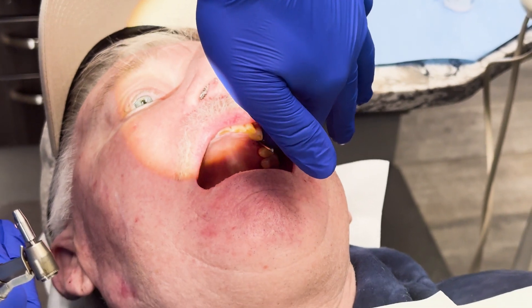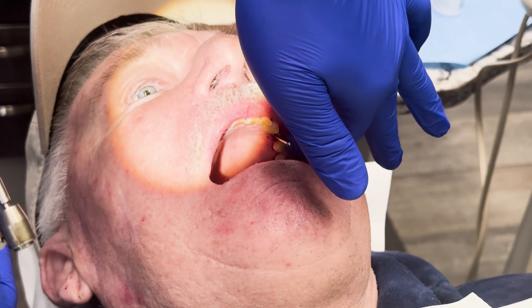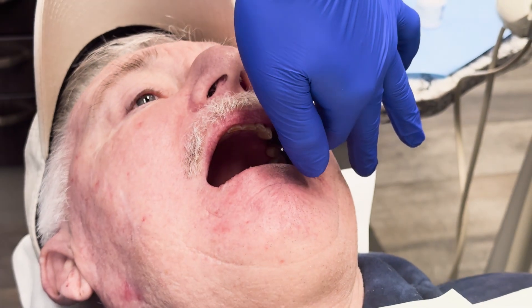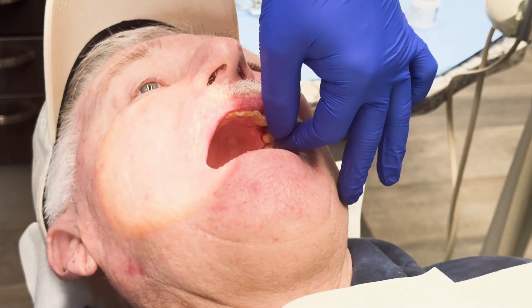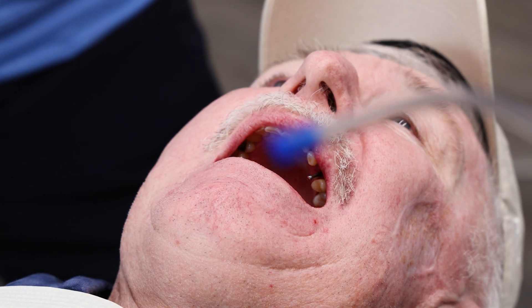It's a little distal palatal, closer to number 13, because that's where the bone seems to have healed the best in the last couple months. You could also take a CT at this point to make sure you're at the right angle — you can just do it with the pilot drill, that's a pretty safe way to do it. I'm pretty sure I'll be okay though, so I'm going to just place that implant right away.